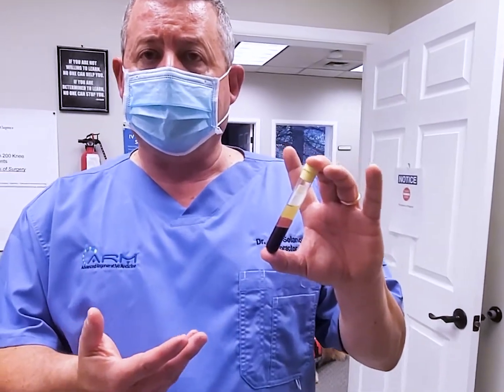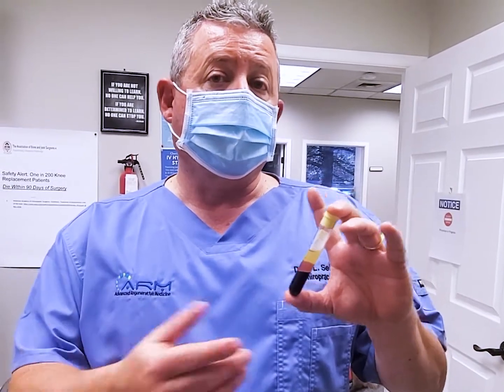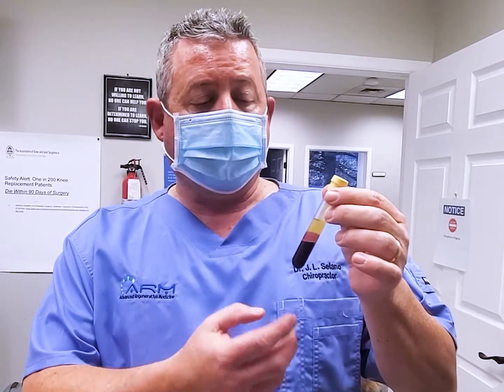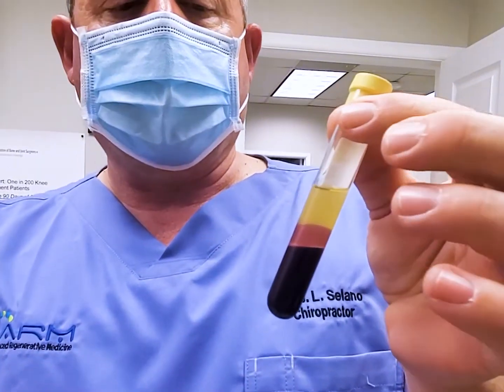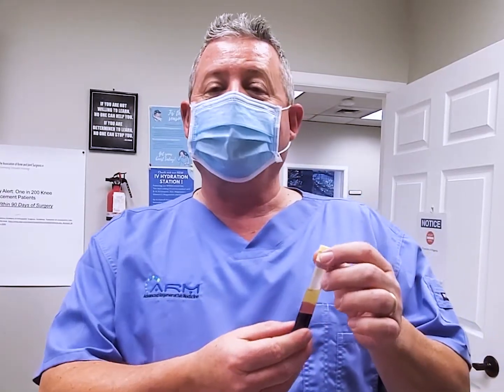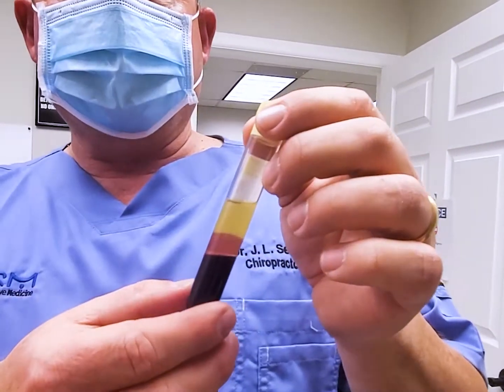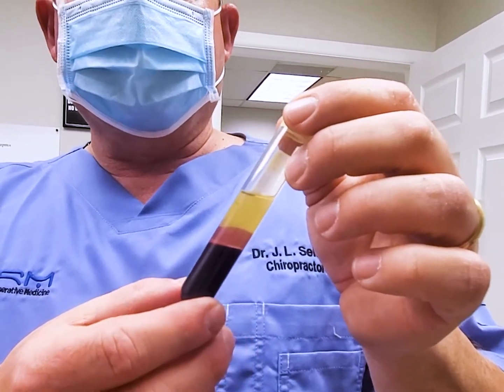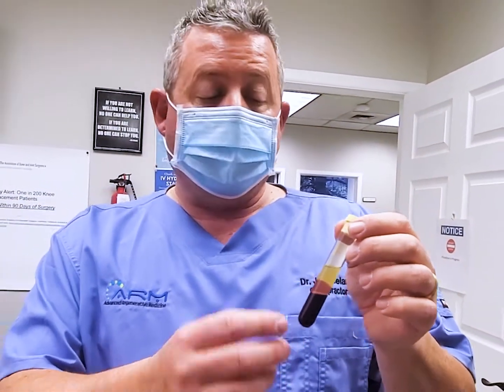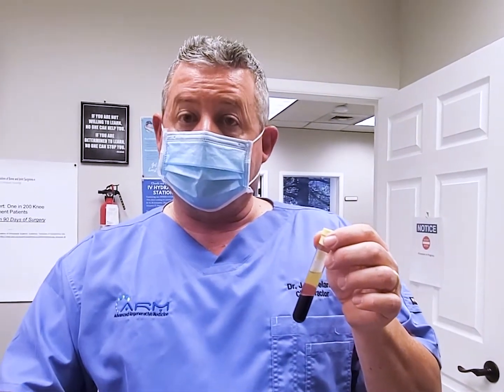First thing we do with PRP is we take your blood, so it's actually you going back into you, so there's no chance of rejection, and then we spin it. Now, the red blood cells you can see here at the bottom, they're heavier, so in the centrifuge they go down to the bottom, and up here is the plasma. So PRP is platelet rich plasma, and inside here we have all kinds of platelets, but we've also got growth factors, and we've got some special proteins that are really good for helping build cells. And we're going to draw out just this amber colored portion and put that back into Johnny's knee.